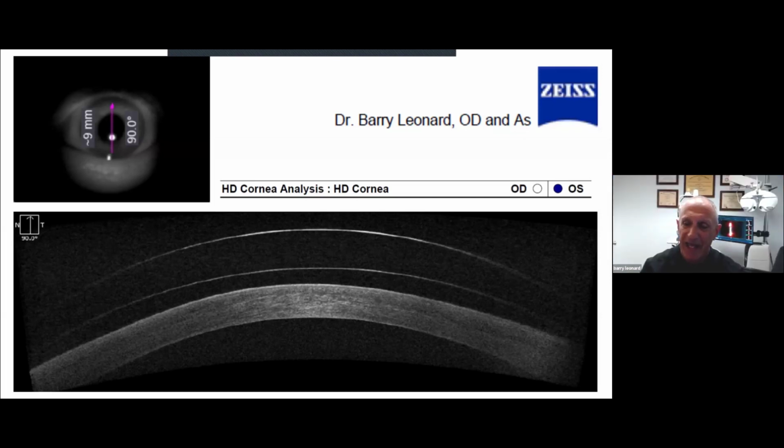Not yet. And I believe now with this newer design, in the past, if we were just changing that edge, and even if you put in 500 microns of toricity in just the edge, how much is that really going to do? But these new lens designs, Zen bi-elevation being one, but there's others doing that with these oval optic zones and basically making the same bi-elevation type of lens. We can now use much more of the sclera to really hold that lens on there, because I don't think we'd ever get it with just the edge design. It just would decenter. We'd put it as much as we can. I hope that answered your question.